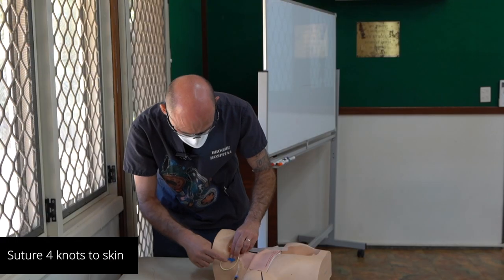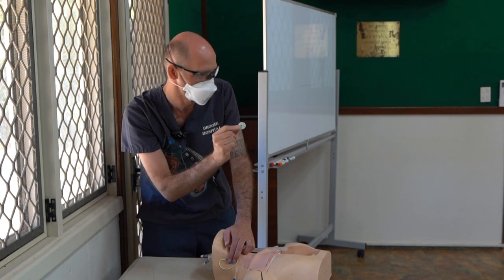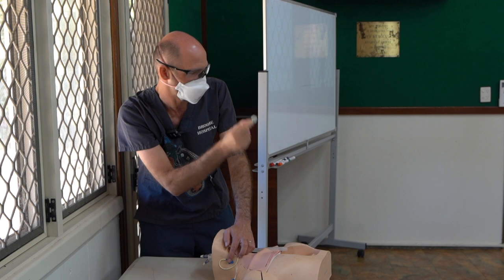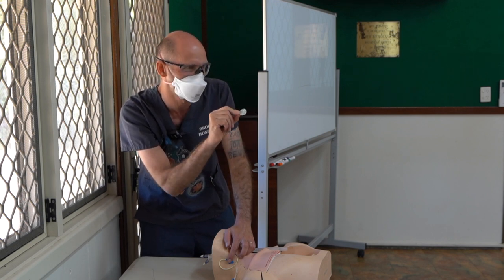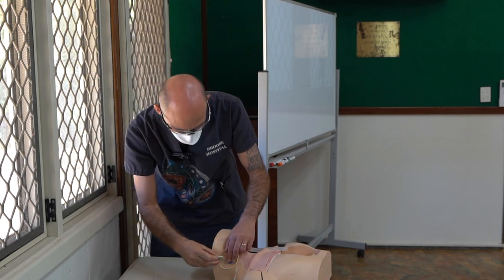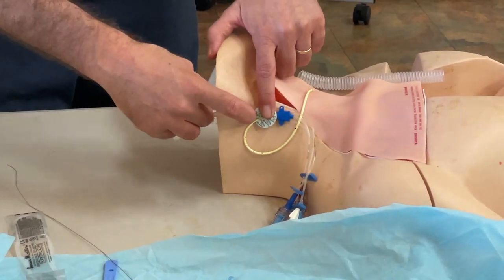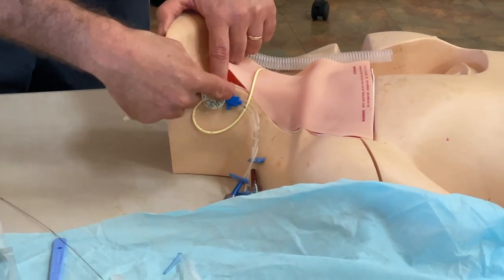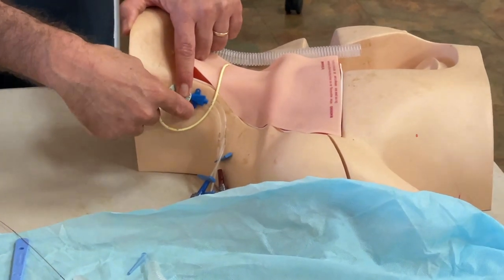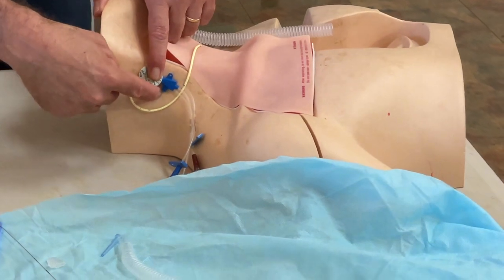Being honest — what I'll then do is get a syringe and pull back some blood, because I like to see dark blood come out of it. As soon as I see dark blood, I'm happy. Then I get saline and flush all three ports with the pressure bungs on. I doubt it's going to clot in the next 10 seconds. Then securing it — I'll wrap it in a little loop and suture it in with prolene. I'll get one of these little bio-patches — blue side towards the sky — and that goes where it inserts. Then a couple of prolene sutures through each side. Put some local anesthetic in there if you haven't already through your field block, because it will sting otherwise.